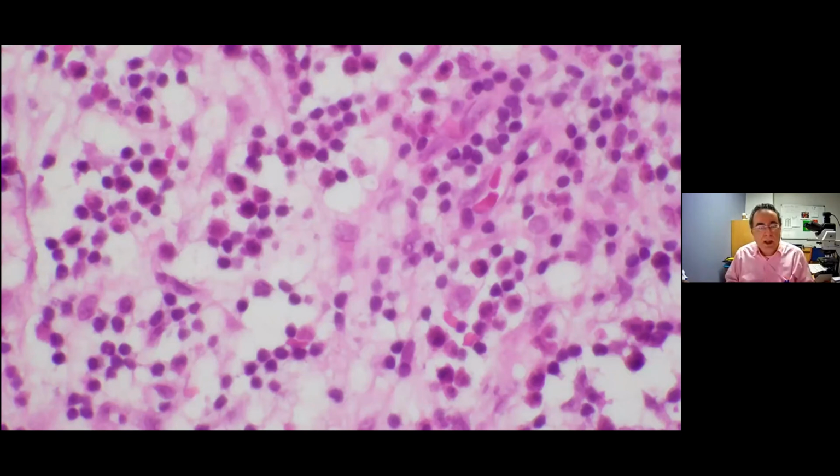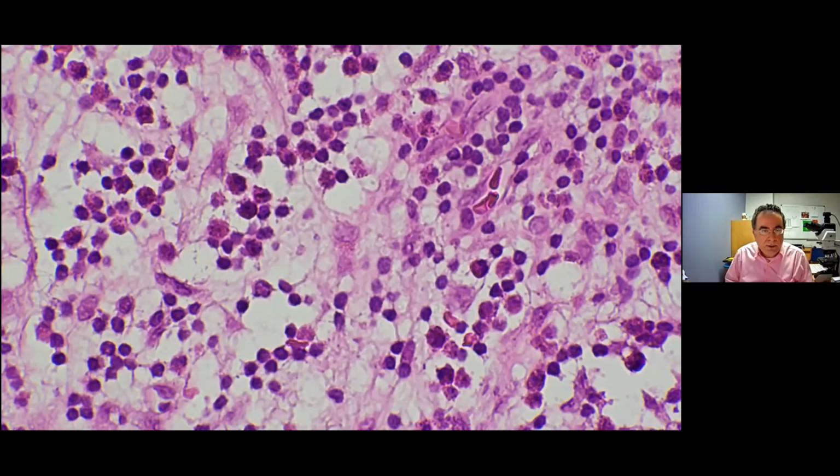So we have a lesion that is composed of eosinophils and some different cells that are in the background. And next slide. So this is better, we flip the condenser, we place some optics, and we can enhance the granularity of the eosinophils. So here you can appreciate the abundant number of eosinophils within this lesion.